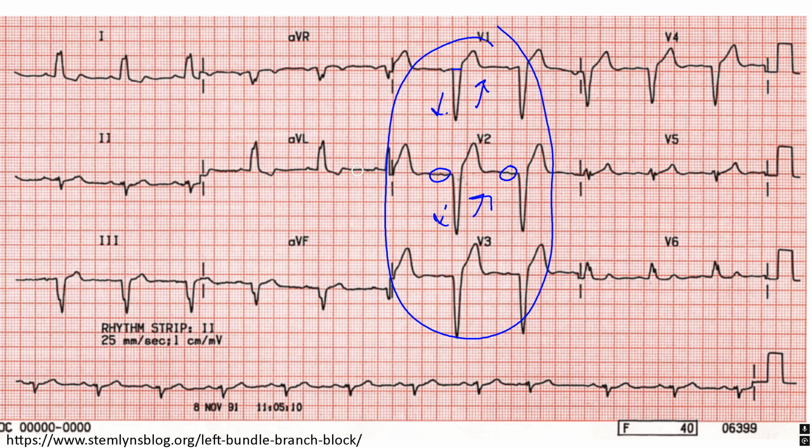Another thing you can do is take the EKG and rotate it 90 degrees to the right. If these QRS complexes are pointing to the left after you do that, it's a left bundle branch block. If they're pointing to the right, it's a right bundle branch block. It's that simple. That's all you need to know. Another thing I'd like to point out is that normally in a left bundle branch block, it is appropriate to see left axis deviation, and that's part of the criteria for a left bundle branch block. But just keep it simple. Greater than 120, if it's down in the precordial leads, it's left. If it's up in the precordial leads, it's right.